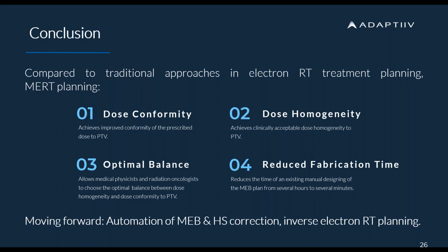So Zach's asking if the hotspot correction algorithm works by decreasing the height difference between peaks and valleys in order to decrease the hotspot dose. Borko? Yes, what our hotspot correction algorithm is doing exactly is reducing the peaks. It doesn't touch the valleys. That's, I would say, a secret ingredient.